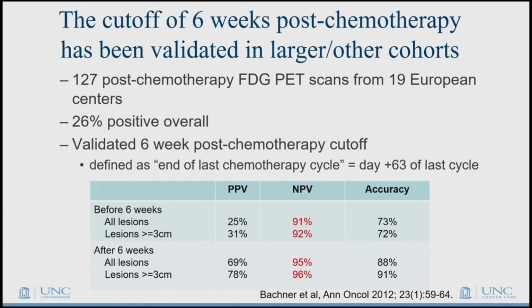And I think one point to really stress here is the timing of the PET. This study looked at time from end of chemotherapy to PET, and then several other studies have validated it. But really, the PET needs to be done well after chemotherapy with a cutoff of 6 weeks. That's been validated in multiple studies now.